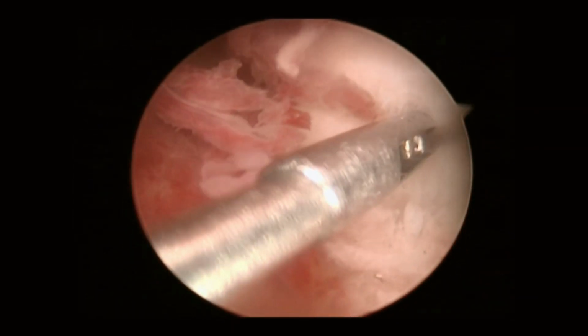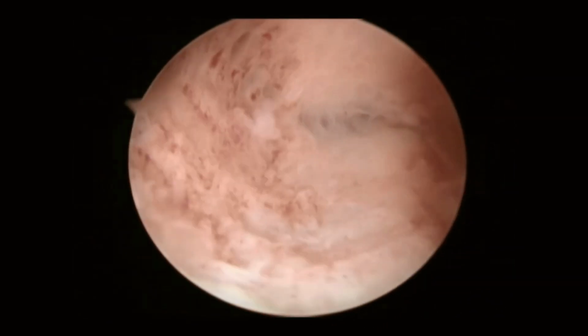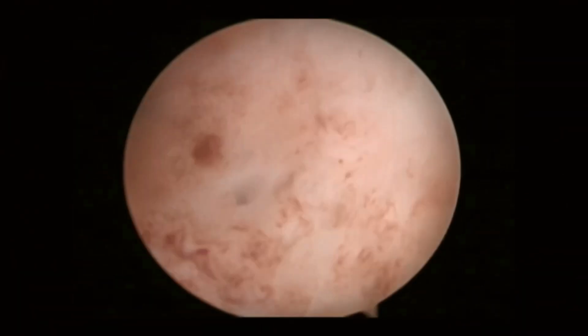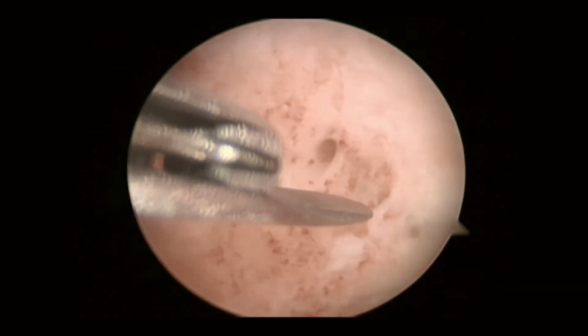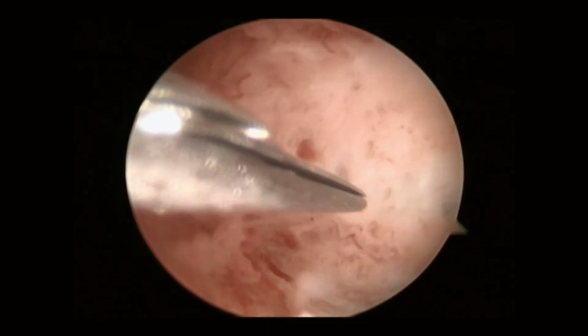Now complete clearance has been done. We have reached till the fundus. Now in the total cavity, we can see both the ostia. Some remnant portion which is seen can be cut, and you get a good view of the cavity after you finish the procedure.